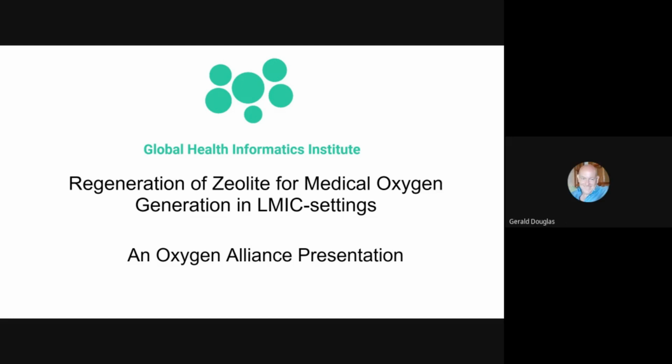So the volumes obviously are much bigger. We might have 4 liters of the smaller zeolite, ranging from 0.4 millimeters in diameter to 0.8 millimeters in diameter. This is the common size used in the oxygen concentrators, whereas in the PSA plant, it's a larger size granule, roughly 3 to 4 millimeters in diameter, I believe. But the process is essentially the same.